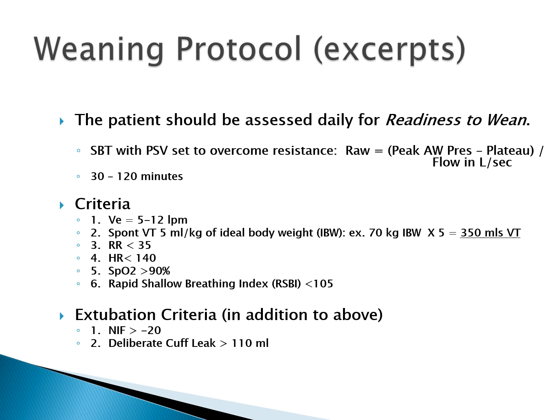Some of the criteria, and I don't mean to say this is all of it: the minute ventilation of 5 to 12, if it's a very large person, maybe a little north of that, 5 to 14 or 15. Then the spontaneous tidal volume of at least 5 mLs per kg of ideal or predicted body weight. Someone such as me, almost 5'10", I probably weigh about 180 pounds. Somebody about my size, maybe a little less large, you'd be looking at a spontaneous tidal volume in the mid 300s.